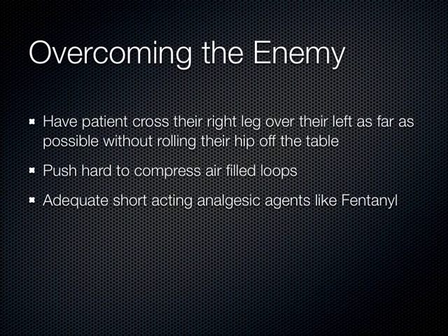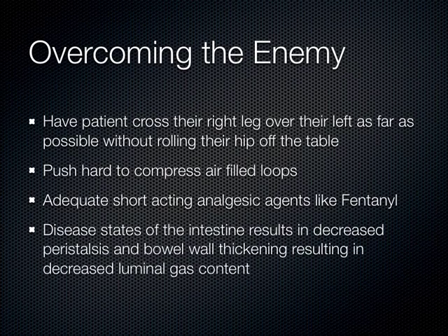And then you'll see, sometimes you have to use two hands to do this compression. And again, I keep coming back to this. When you have a disease state that reduces the amount of peristalsis, there's more bowel wall thickening, and there's less intraluminal gas, and all of this makes it easier to visualize the intestinal contents.